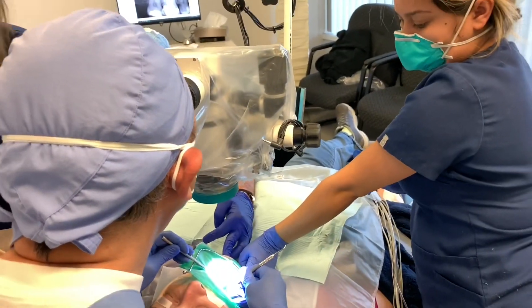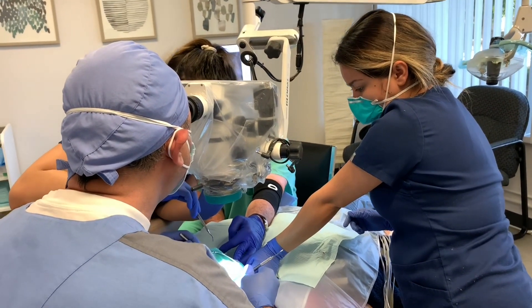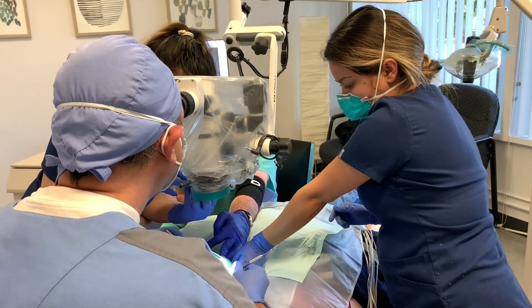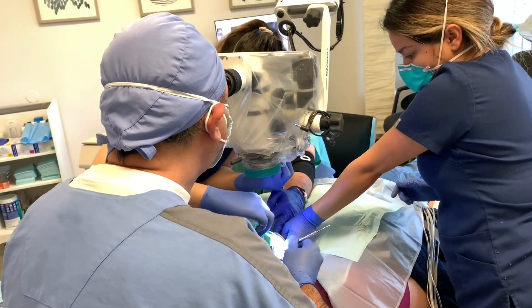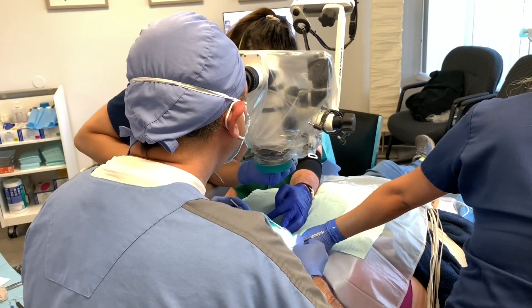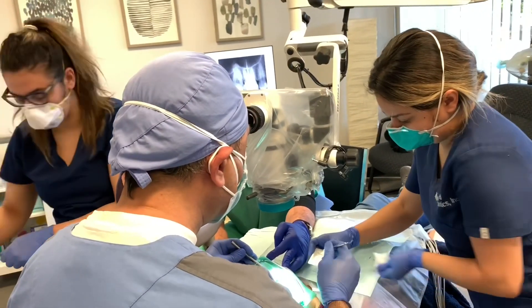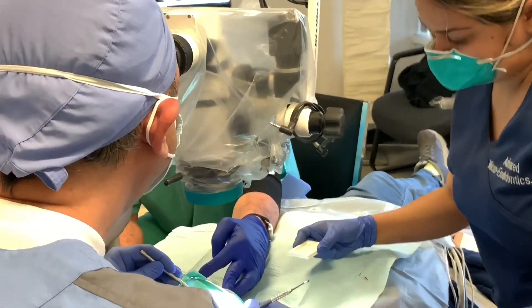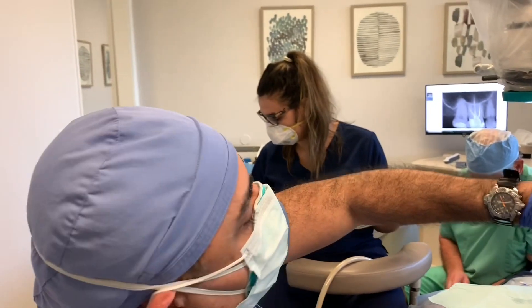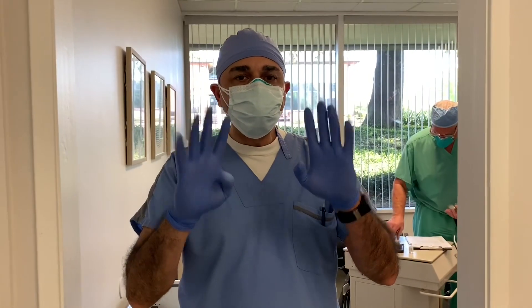I'm done with obturation — I placed a piece of sponge in the canal, cleaned the pulpal floor with 70% isopropyl alcohol on a cotton pellet, and now Biodentine is going in. I already reduced the occlusion at the beginning before I got started, so this tooth is out of occlusion. We use water to activate the Biodentine. Canal system complete — done in 25 minutes, four canals, 25 minutes!